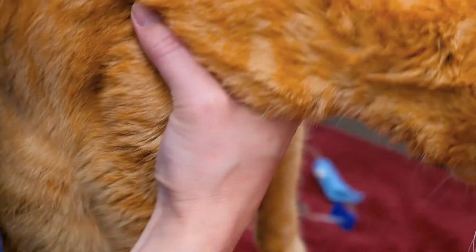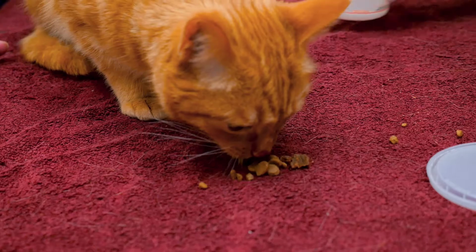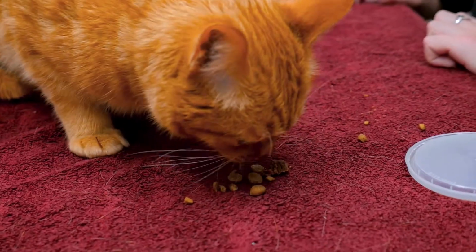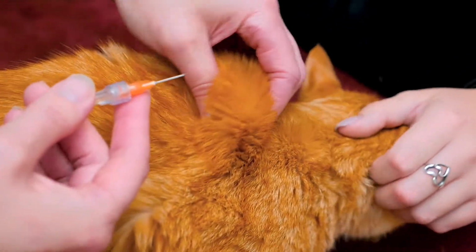So we're just going to open up some food for Hobbs and see if he's going to nibble his way through this. The more you can distract them, the better. So if they're willing to eat through this and make it a happy experience, then that's the best thing to do.